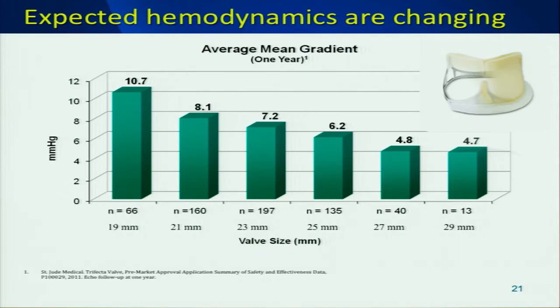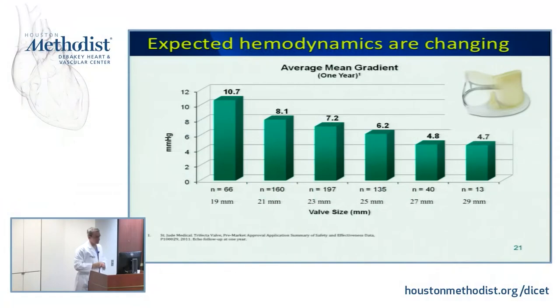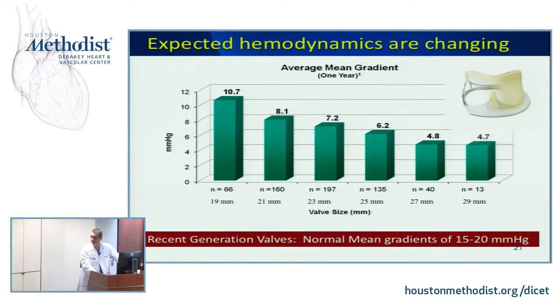So great hemodynamics. And I'll tell you, and you've seen these cases, now that we've been implanting these for about 5 years, we're noticing that they tend to be getting into hemodynamic trouble. Now a bunch of them are coming back to us. So there's always an expense with these innovative designs. Great hemodynamics, but the longevity, the calcification, the propensity to obstruction now at 4 and 5 years is becoming a concern. So this technology may not get the 15 years that we used to quote for a bioprosthetic valve. But the early hemodynamics, at least, look really good.